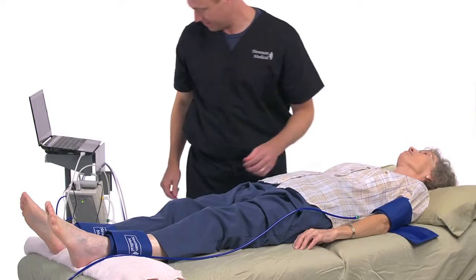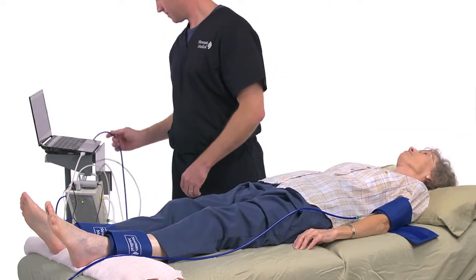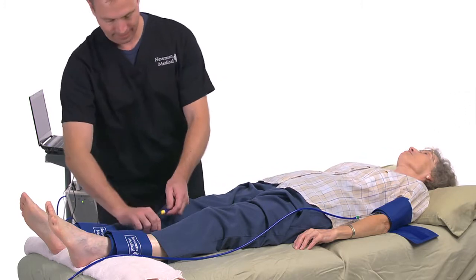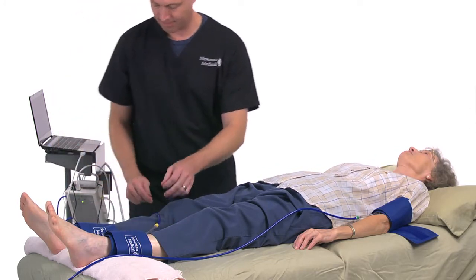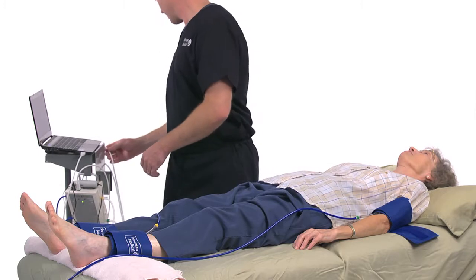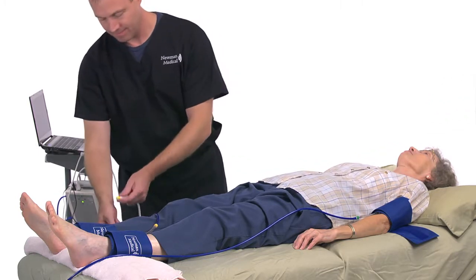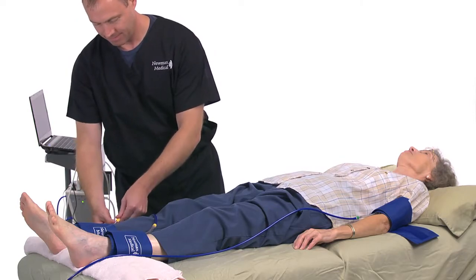Have the patient lie down in the supine position, relaxed with their head and heels supported in a comfortably warm room. Wrap appropriate-sized cuffs — usually 12 cm on the arms and 10 cm on the ankles — as explained in the section on cuff wrapping. Attach the color-coded hoses. On the computer desktop screen, select the Simple ABI icon.